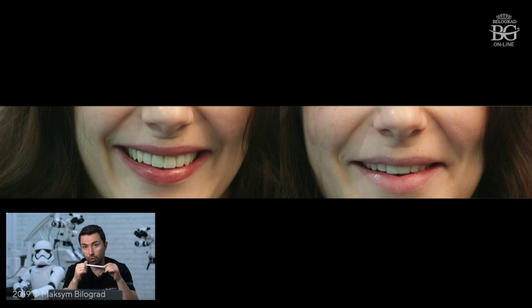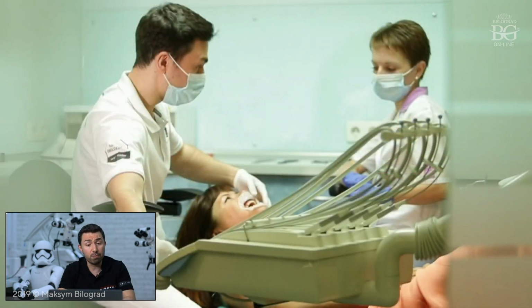And if you make any single adjustment of the mock-up, you will have to take an impression, because this impression will guide your dental technician regarding the shape that he will have to give you for the final veneers. We worked in an analog way, because this is a case from 2012, a pretty long time ago, when we didn't have any intraoral scanner and digital protocols were not used. So once we got acceptance, once we were satisfied with the shape of teeth, we started preparations.